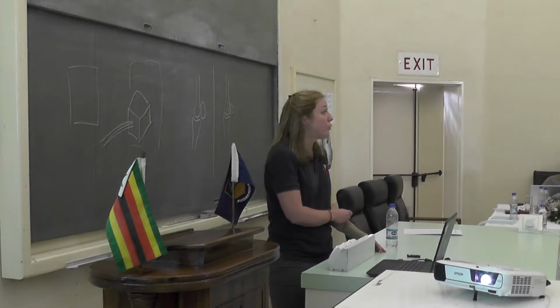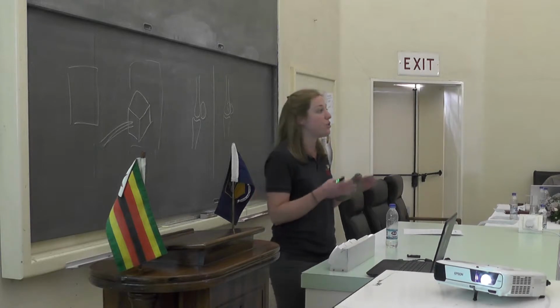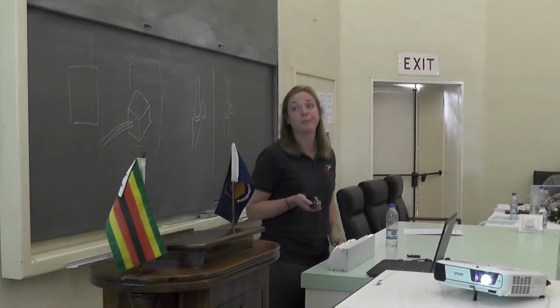So, like Ben showed in the first lecture, if you want to image a limb that's covered with dried mud and all sorts of things, at the end of the day, when you get an image with all sorts of different structures of different lucencies, you don't really know if that's a bone fragment, if it's a little bit of solidified mud that shows up on X-ray. So you need to make sure you eliminate all of those things to then objectively interpret your image and take adequate conclusions of it without being fooled.